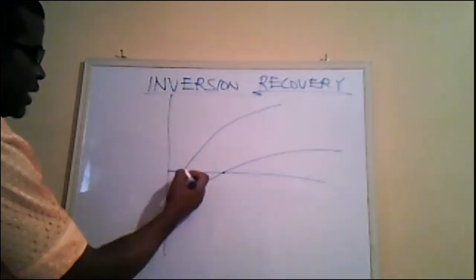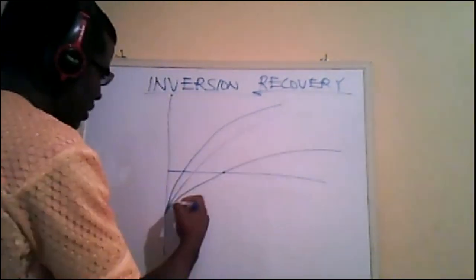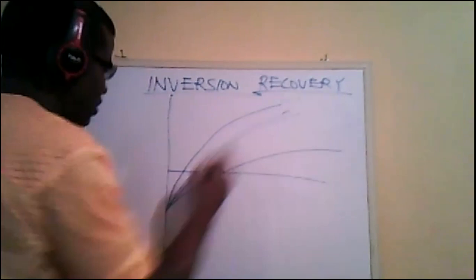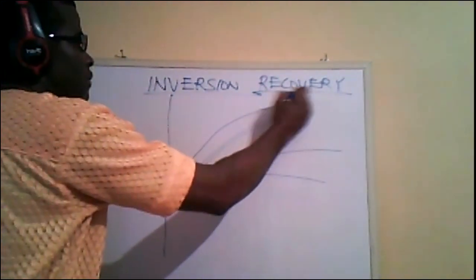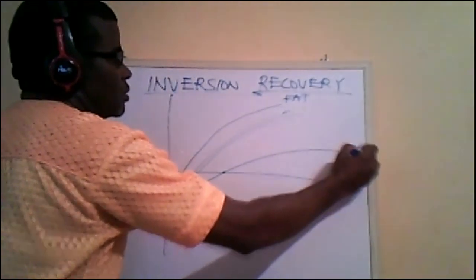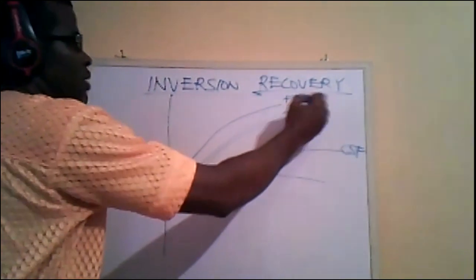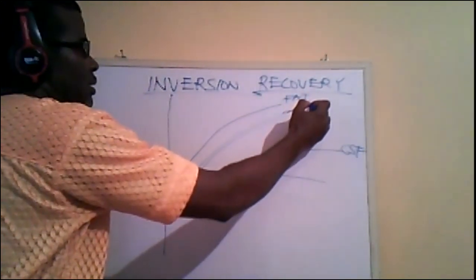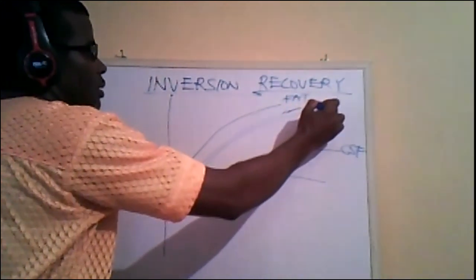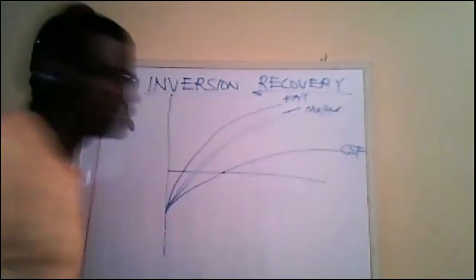At every point in time, whereas you can have both white matter and gray matter, any point in between them. This is for fat. This is cerebrospinal fluid. One is a white matter, one is a gray matter.